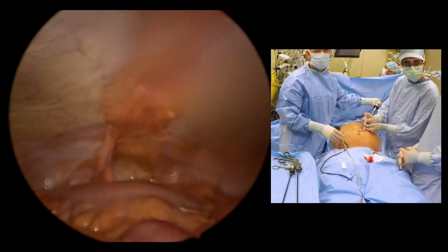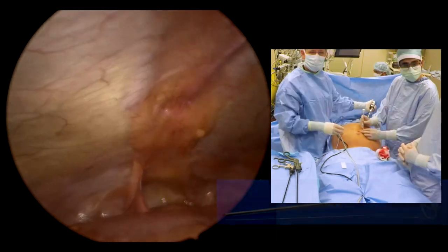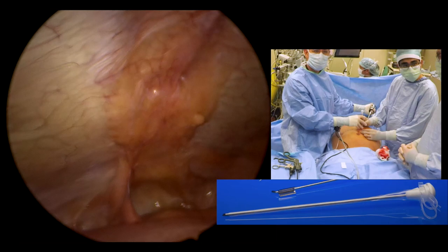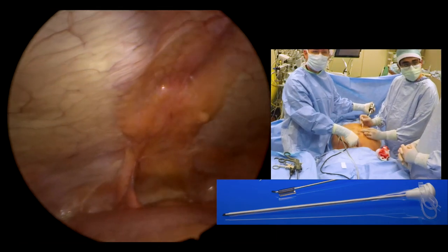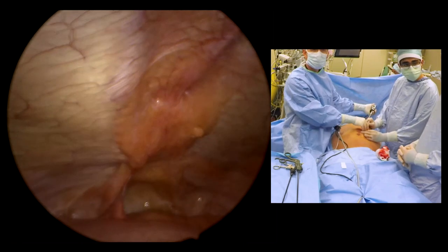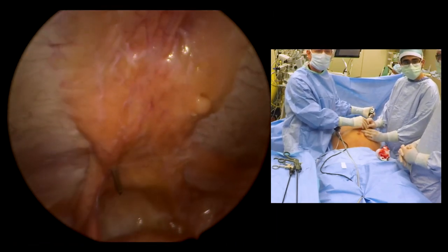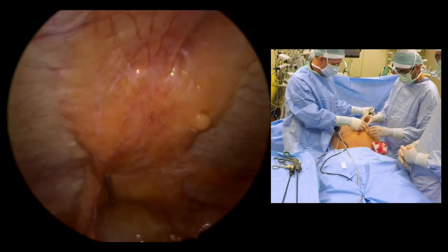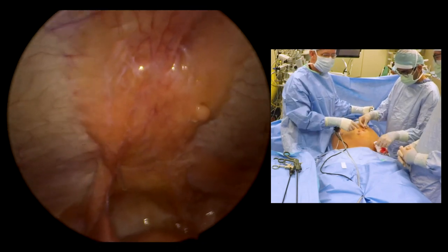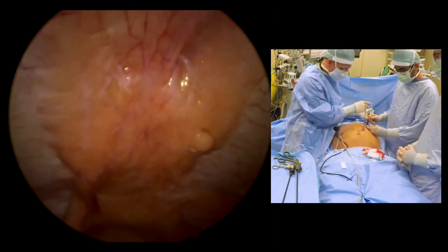We then use local anesthetic for hydro-dissection through the rectus sheath. Shown on screen is a loop guide assembly, which is a sharp metal trocar wrapped by a plastic peel-away sheath. It is inserted into the rectus muscle at a 45-degree angle, which helps maintain the projection of the catheter towards the pelvis as well as prevent catheter migration and malfunction. The cannula and trocar are removed, and the sheath is left in place, secured by a hemostat.